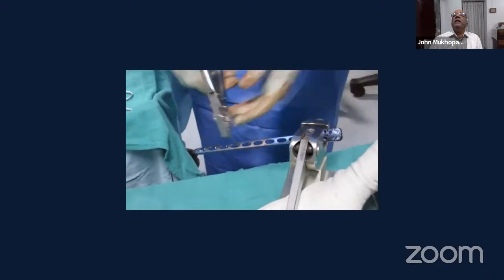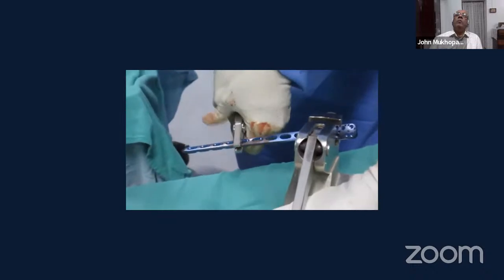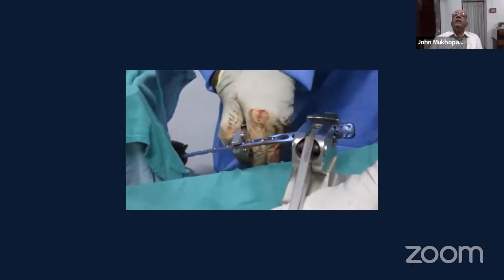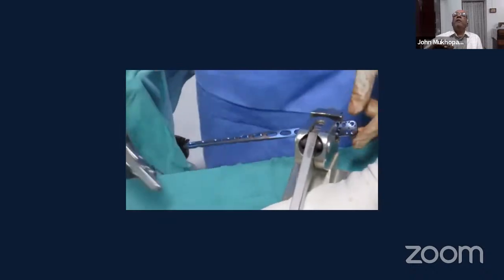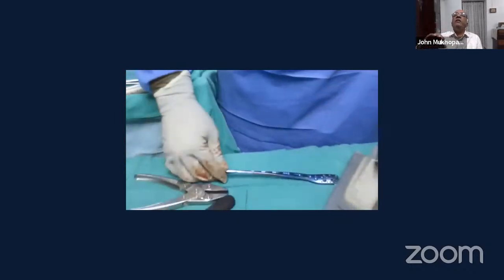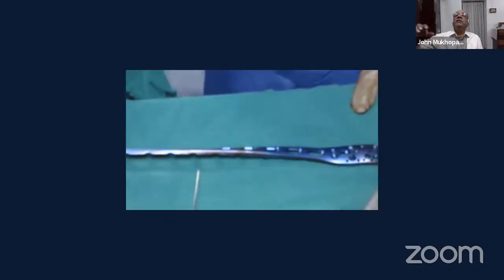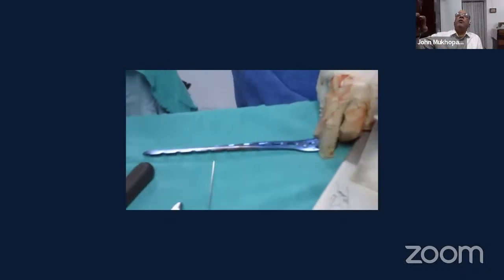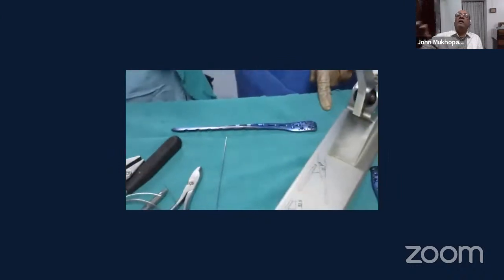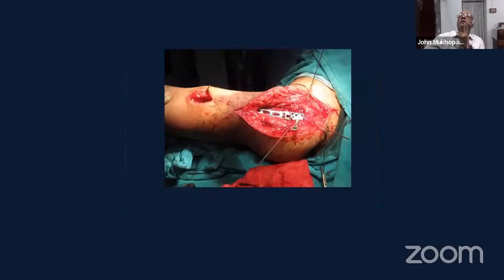Now you can see the proximal part is in a vertical direction while the distal part is almost in a transverse orientation. When you do it this way, it will twist almost evenly. So now you can see how the two sides are in different directions. You can have the proximal part on the lateral surface and the distal part on the anterior surface of the humerus. So this is how it's done.